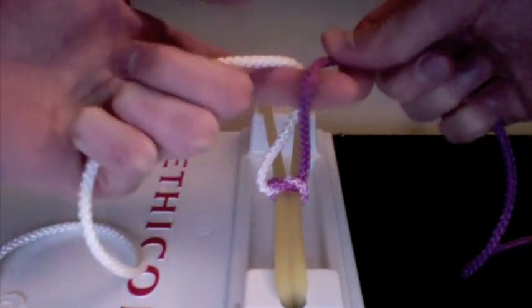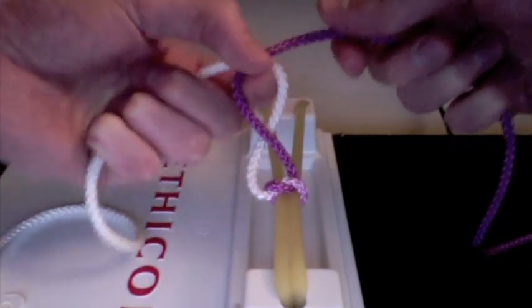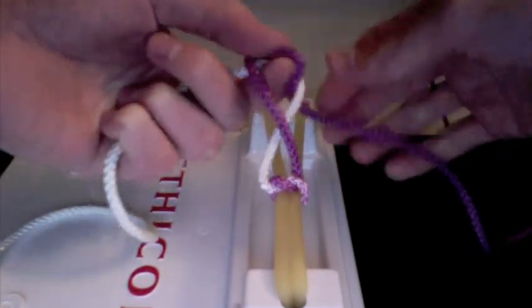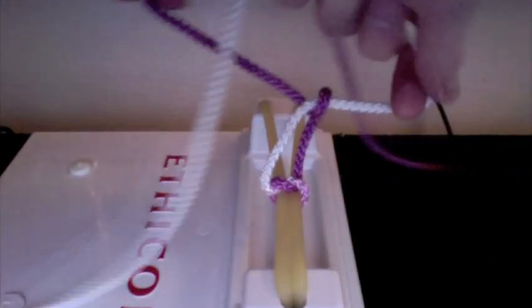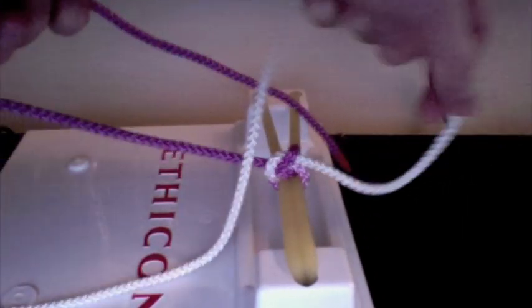We're going to do the exact same thing: make our bird beak, bird goes out through the hole. Not letting go of these two fingers — just rolling it right out. Grabs the worm on the other side, pulls him through, and grab on the other side. Now, if we pulled this down it would be all twisted, so what we actually have to do is cross our hands and lay that down so that it lays nice and flat.